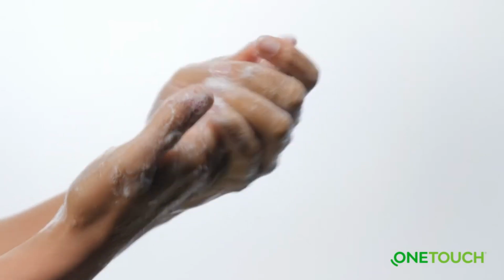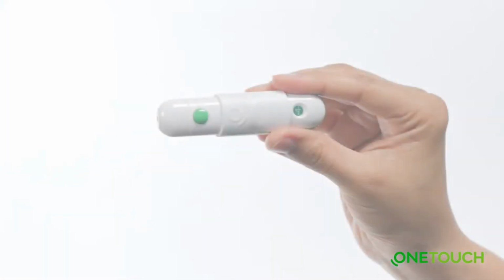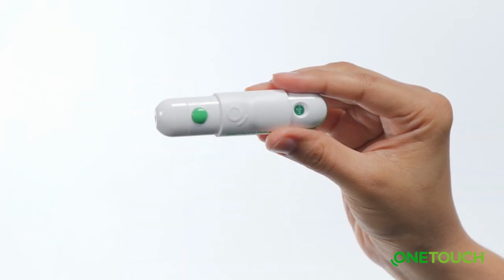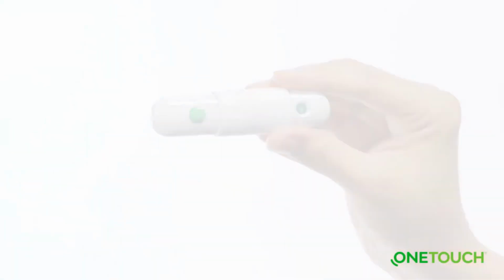Wash hands thoroughly with soap and water after handling the meter, test strips, lancing device, and cap. Used lancets and test strips may be considered biohazardous waste in your area. Be sure to follow your healthcare professional's recommendations or local regulations for proper disposal.